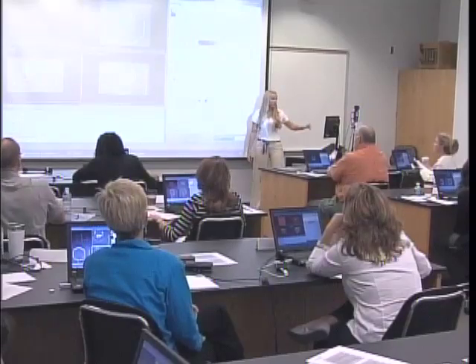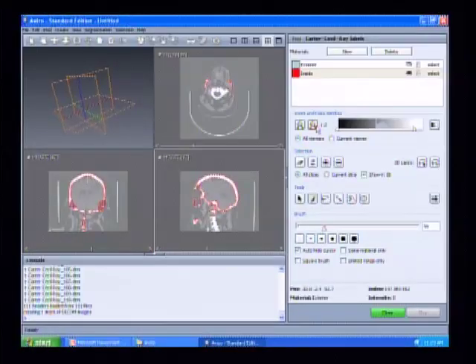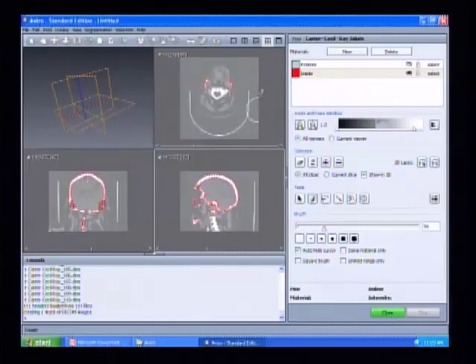If you come in this top XY plane and cross it out like I did, where I just removed a slice, you have this whole volume that's the top portion of the cranium. Then I cut off a piece of the vertebrae, and I still have the rest of the vertebrae in another volume. But because I separated this one, the two are no longer touching. So what you could do, which will save you a lot of time, and hopefully these two dots right at the top of that particular vertebrae won't be a problem, but we can see.